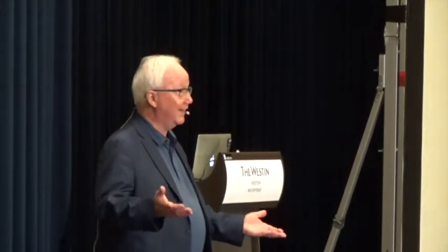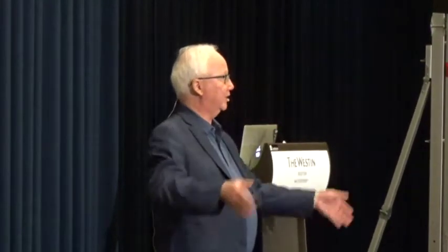Now, with my radiology hat on, that doesn't mean everybody gets a pan. It doesn't mean everybody gets a cone beam. It means you examine the patient, you determine the need, but I'm telling you, most patients that walk in the door need some type of radiographic examination. And when you do the numbers, if you've got software that does productivity, just have your staff member put in the tools, all the radiology services for a year. Print the report. Don't put anything else for product, just the x-ray services. Print out that printout, and you will sit down because you're going to go, holy crap, I make a lot of money off these x-rays. And it makes you a better clinician when you use it the way I told you to use it.